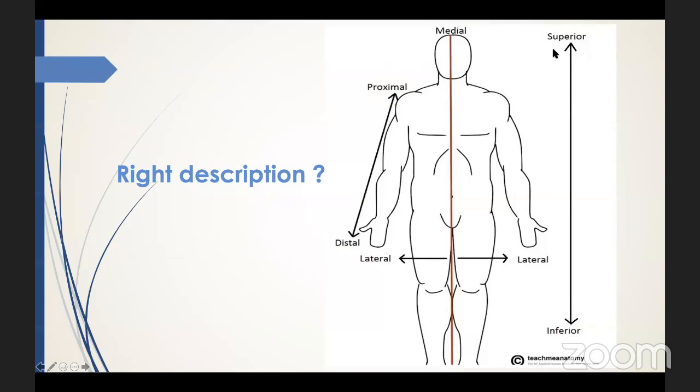And of course, the head direction here is superior and inferior if you were referring to the patient's feet. But some physicians like to get the direction based on the flow direction. So in the venous system, this one would be proximal, and this part here would be distal because of the flow direction in relation to the heart.